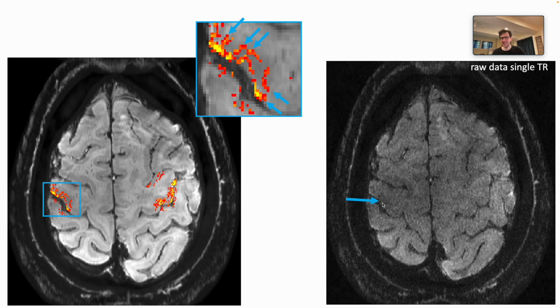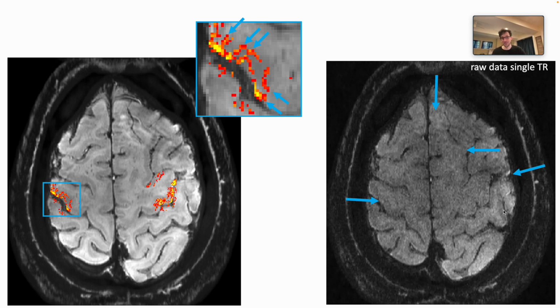For example, there's kind of a dark shadow, very fuzzy, sitting on top of this side, as opposed to that side, for example. And there are these kind of fuzzy clouds, these banana clouds sitting right on top there. Do you see that artifact? To be honest, at the beginning, I didn't really see it myself without a bit of training, but I'm gonna help you and just invert the artifact and make any dark shadows become bright clouds or bright clouds become dark shadows. So you can see that there's a lot of variance going on here.